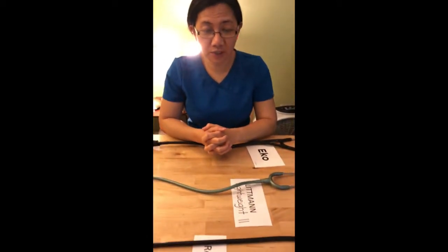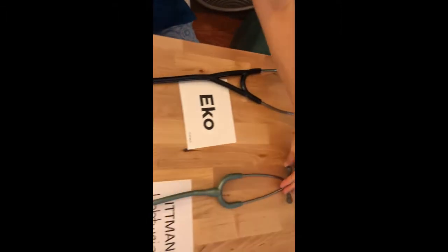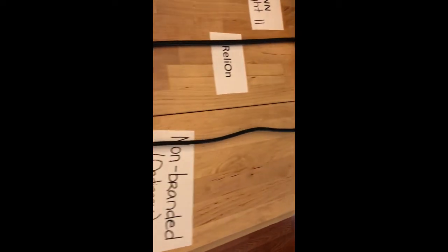Hello everyone, welcome to our website, themedicaldevices.com. We do reviews and videos about different kinds of devices, most of them the latest ones on the market. For today, we're going to compare the Echo Core electronic stethoscope to other kinds of stethoscopes. I have four different kinds: the Echo Core electronic stethoscope, the Littmann Lightweight II, the Rely On, and an unbranded ordinary type of stethoscope.